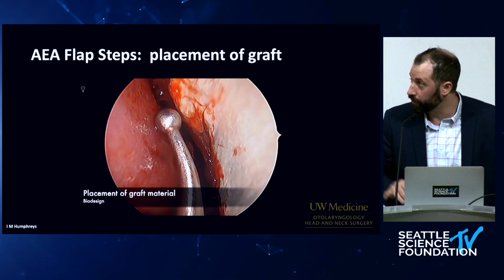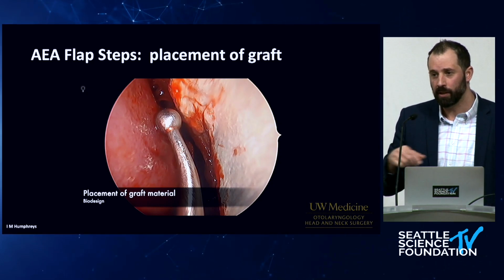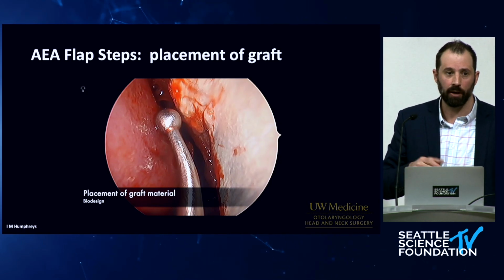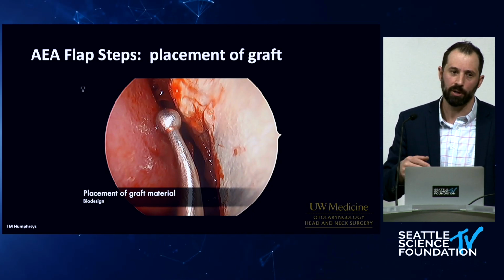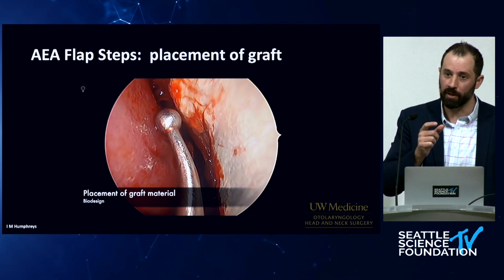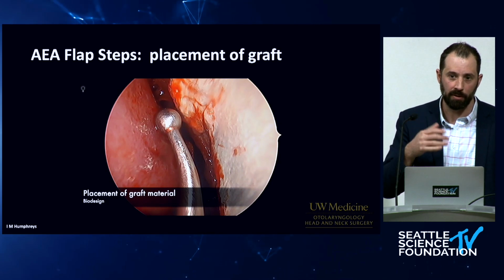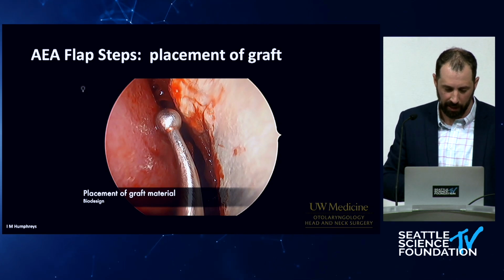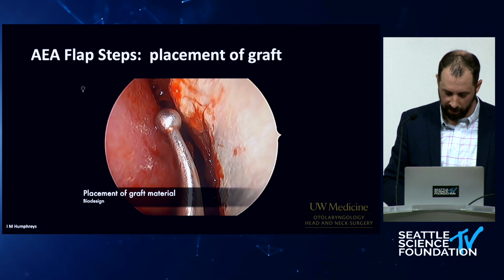In this case, I have shown that you can use implants concurrently with the flap. In the paper that I cited at the beginning, it was a collagen matrix. There are other extracellular matrix grafts that you can use. Pig submucosal or pig intestinal submucosa is a graft that's used or approved for laryngoplasty, tympanoplasty, and septal perforation repair. And there's manufacturers that make that product. So in this case, that's actually what is going in here. And so this is a multi-layered reconstruction in this specific example.